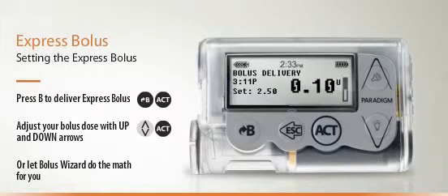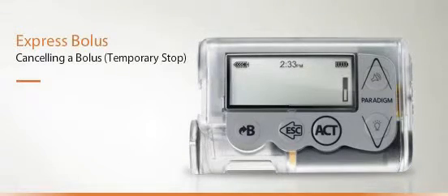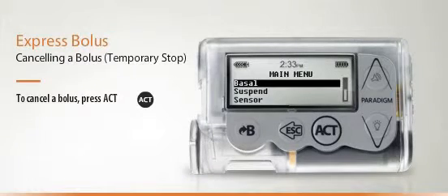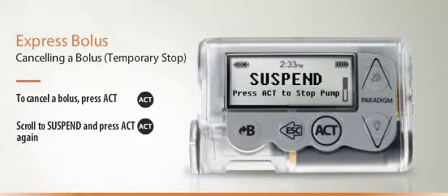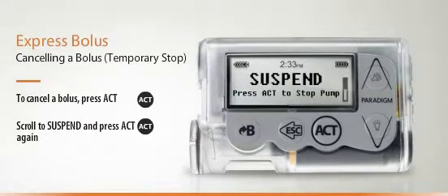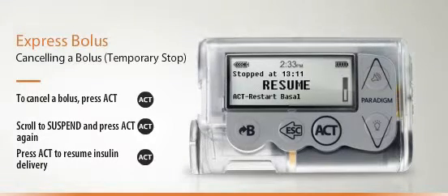If you are using the bolus wizard, it will give you a helping hand by suggesting an appropriate bolus using your preset information. Should you decide to cancel a bolus in the middle of a bolus delivery, you can do so by pressing the Act button. At this point, the Paradigm Veo will halt delivery of basal and bolus insulin. To resume insulin delivery, press Act. You may need to visit the Pump Status screen to see how much of your bolus was delivered prior to suspension.